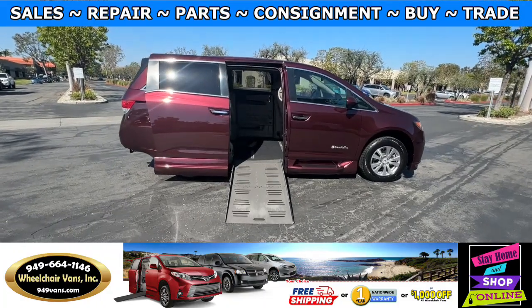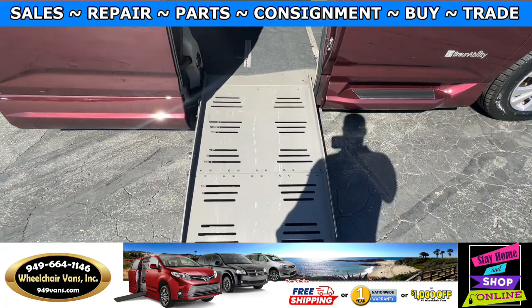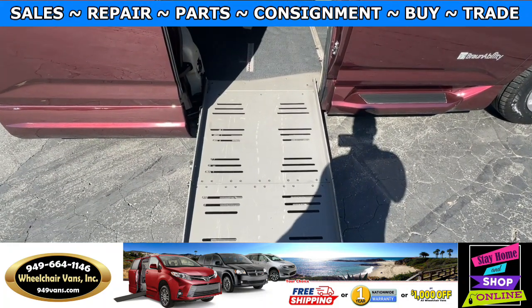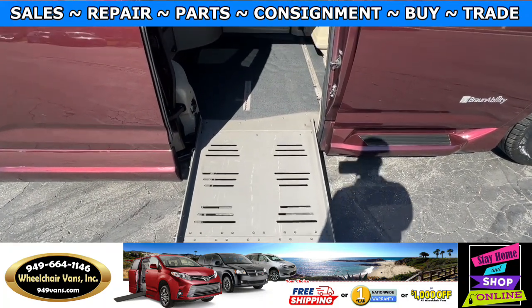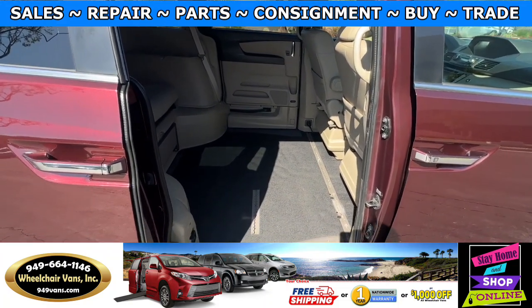Let's head inside and check out the setup. This is the foldout ramp and the width on this ramp is going to be 28 inches. Entrance height from the floor to the top of the door is going to be 54 and a half inches.